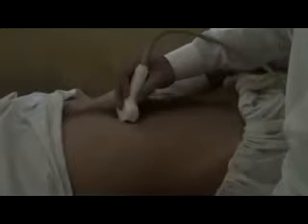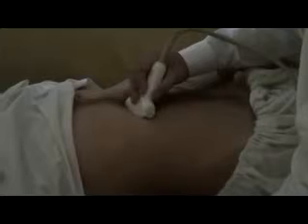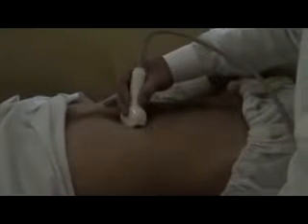Most of the time, this is the area from where you get the gallbladder. You can get the gallbladder from this area. Now the difficulty is in this scanning plane.